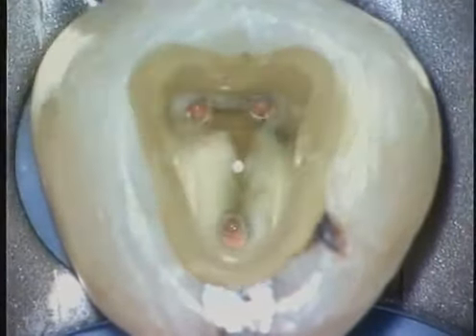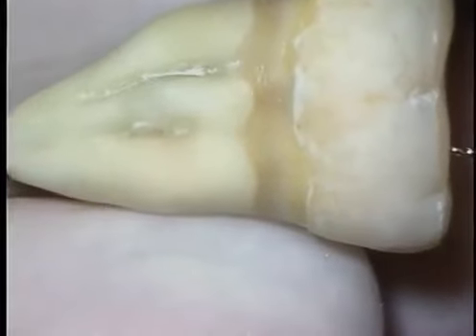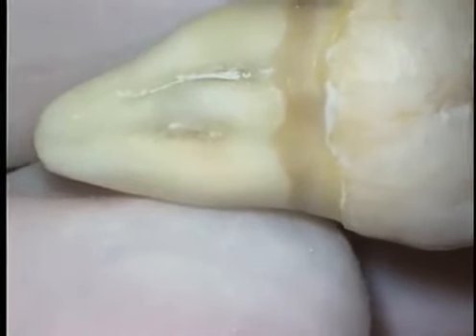Working instruments along this sheath of pulpal space or tissue can sometimes be a little bit daunting, in that you're not sure necessarily where the instruments are. Apex locators are useful, but radiographs are best for confirming the position of the file within the root of the tooth. Looking at the C-shaped molar extraorally reveals its anatomy.